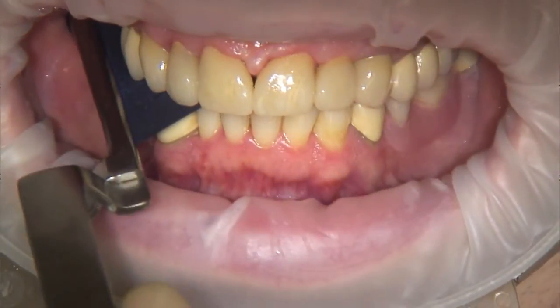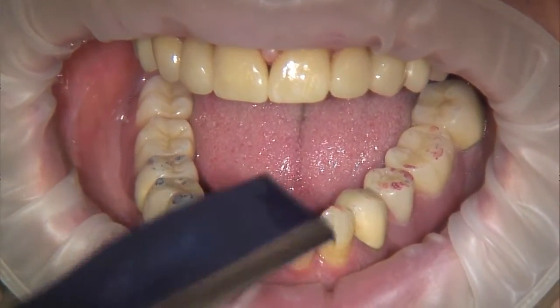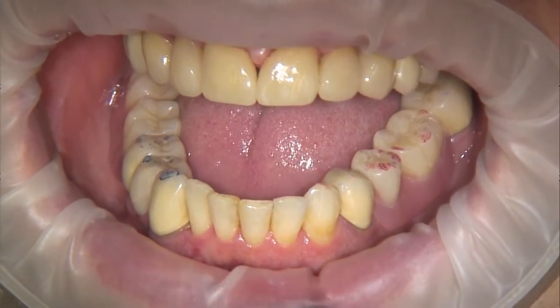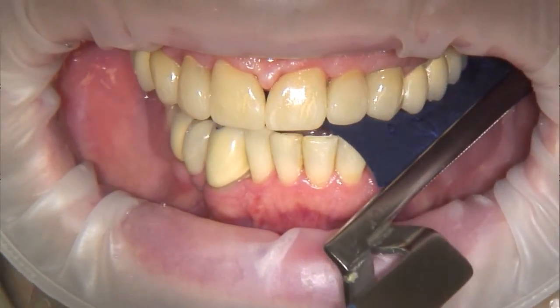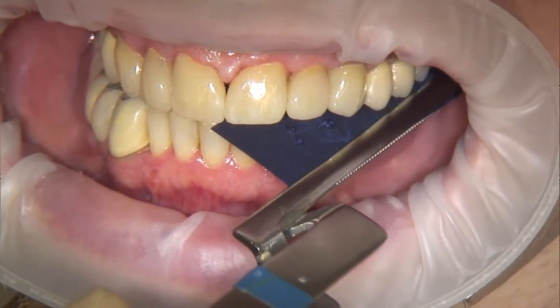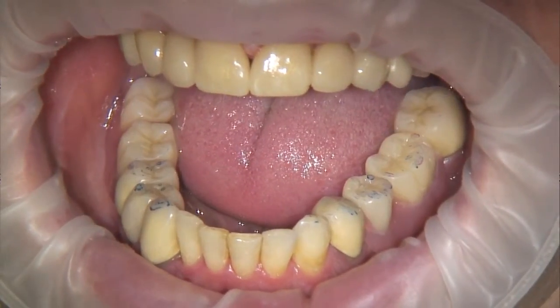When grinding selectively, it should be noted that only darkly coloured spots should be ground. Very often, these spots are mistaken as grease spots. Closer scrutiny of the darkly coloured spots will reveal that only these have a characteristic shape — a small, lighter coloured area surrounded by a darkly coloured circle can be seen in the centre of the occlusal contact. The light, dot-like surface represents the actual occlusal spot.